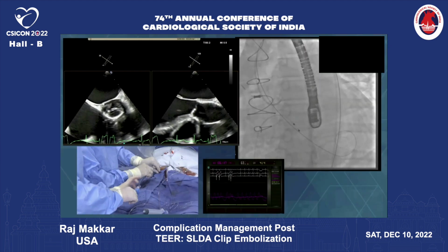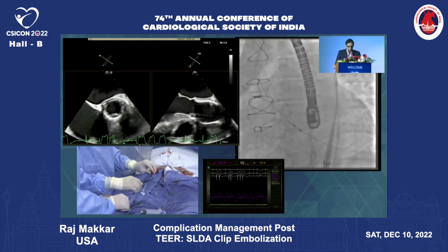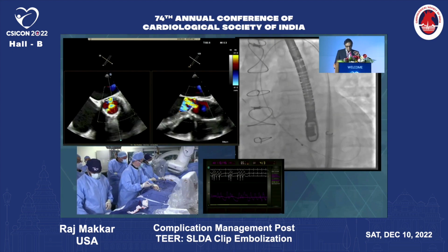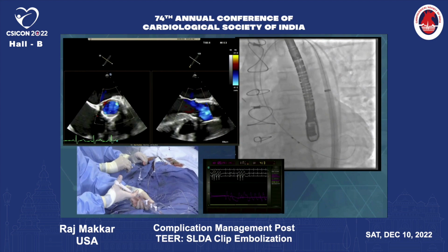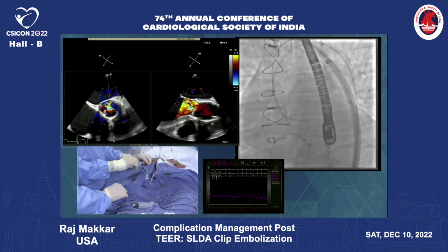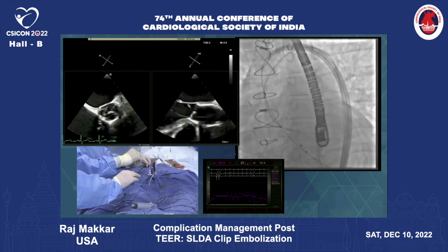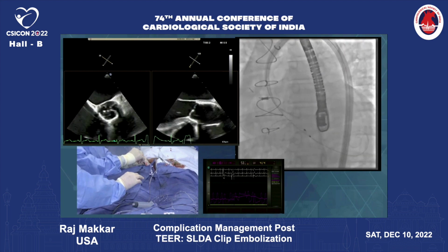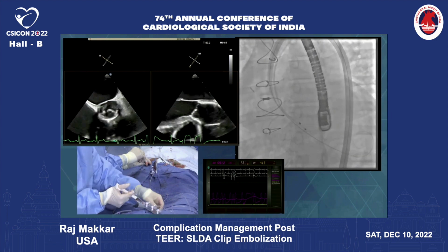So we are gently advancing this, and this is a very, very nice, lubricious sheath, okay? So it's important though, when you're advancing here, to do this very slowly. So I'm going to do that very slowly, to come slowly with this long sheath that comes all the way to the STJ. This sheath is 85 centimeters long, and our goal here is to be, with the old system, they would say at the STJ.